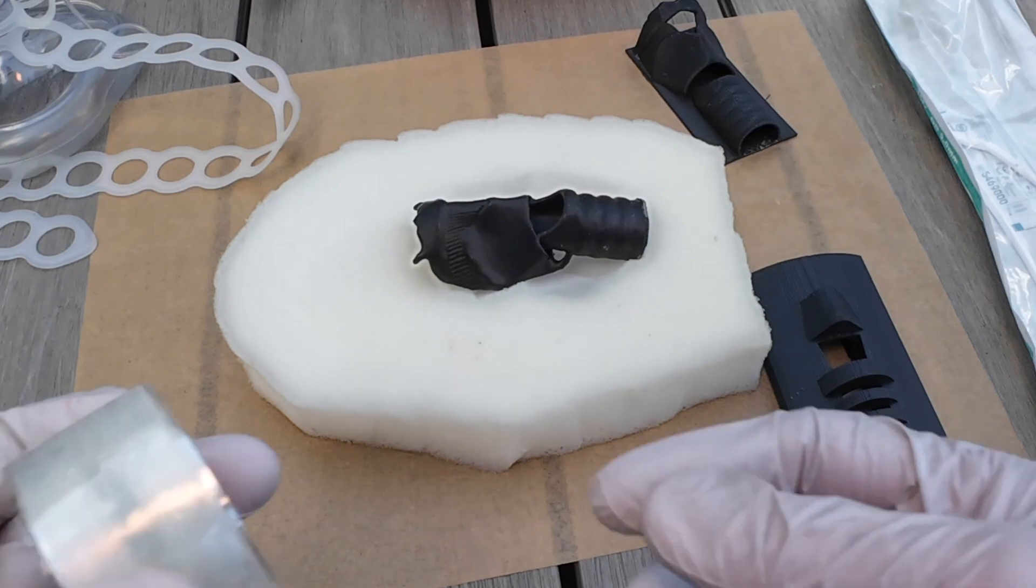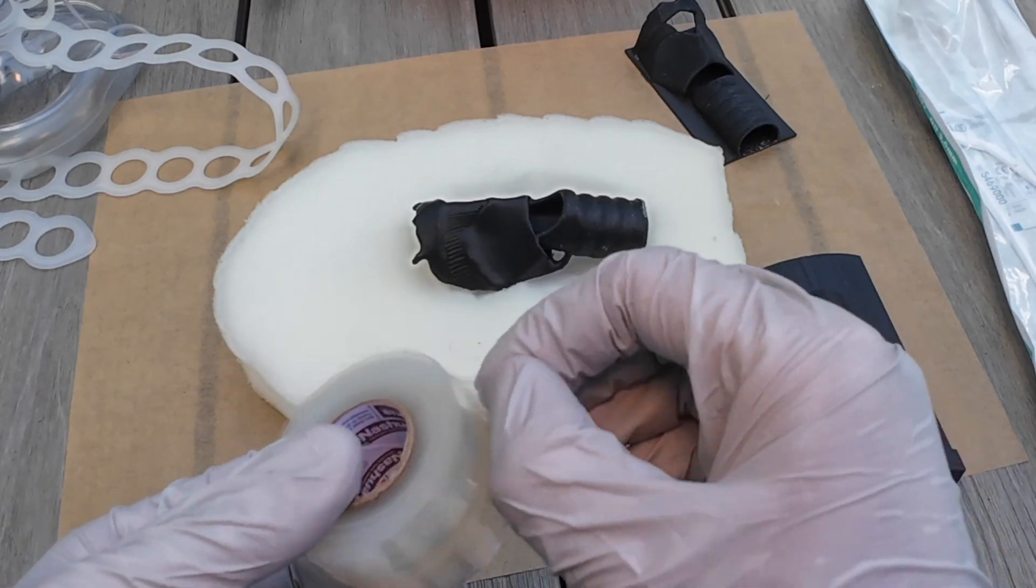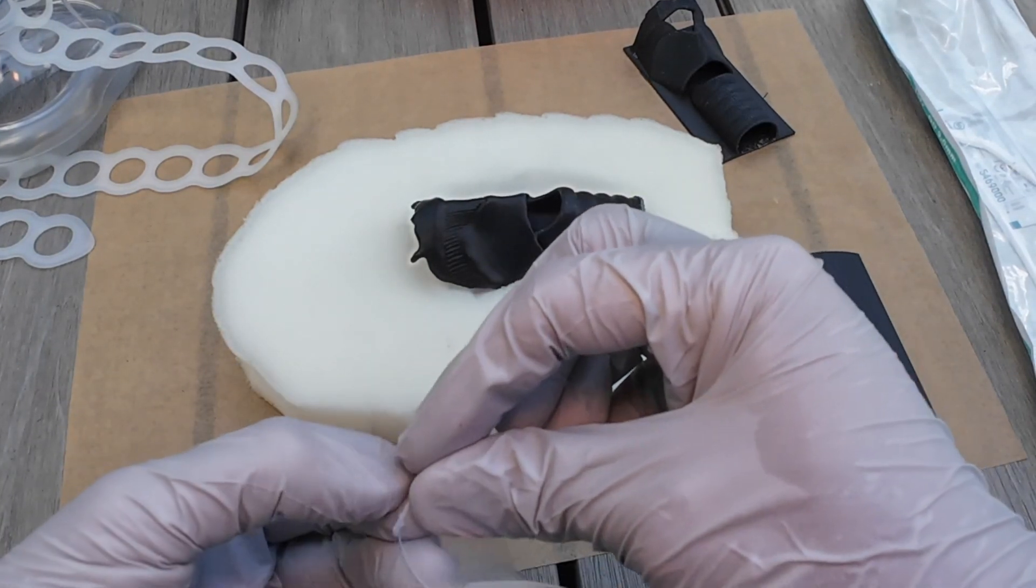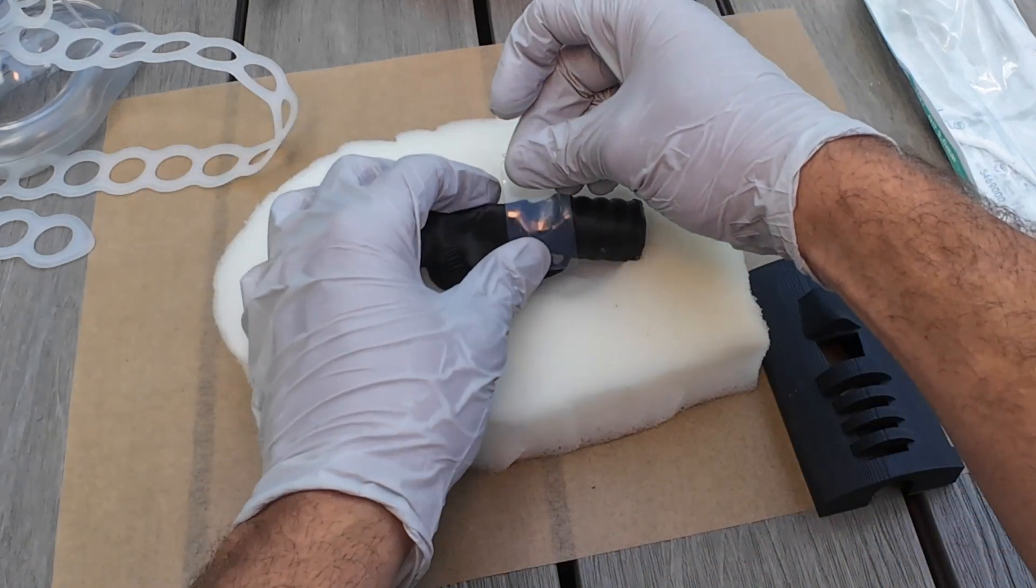What I'm going to do is this one here. On this one, I'm going to do a non-bleeding. So I'm going to take our tape, put it over top. It makes a nice cricothyroid membrane. You can find that tape in the show notes.